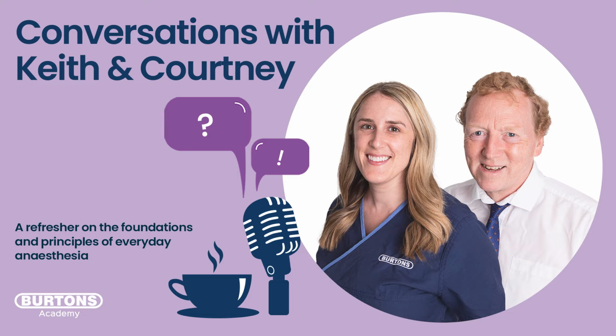So the reduction in cardiac output is less common again. I think changes in production are very uncommon. I think changes in cardiac output are uncommon, or tending towards very uncommon. So the one that we're really concentrating on when we're looking at capnography is hypoventilation. And I'd like to think about that in terms of minute volume.